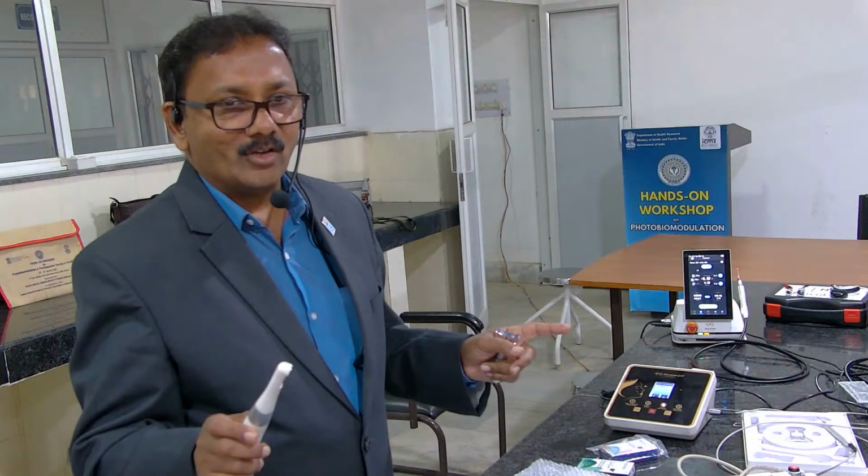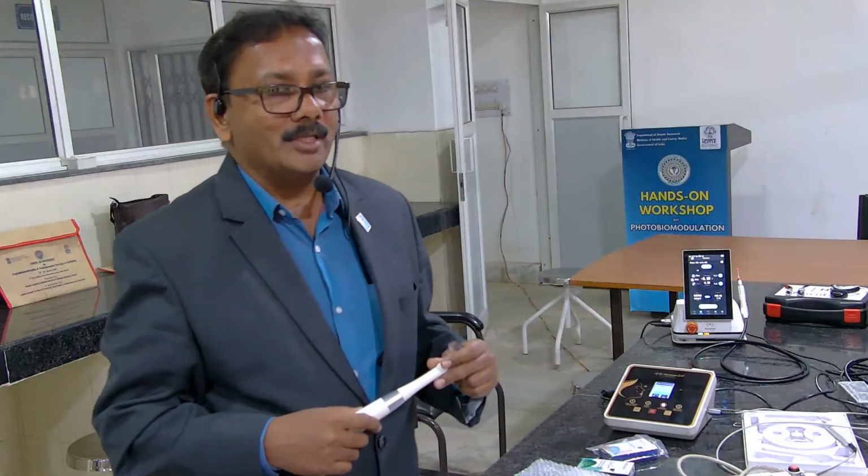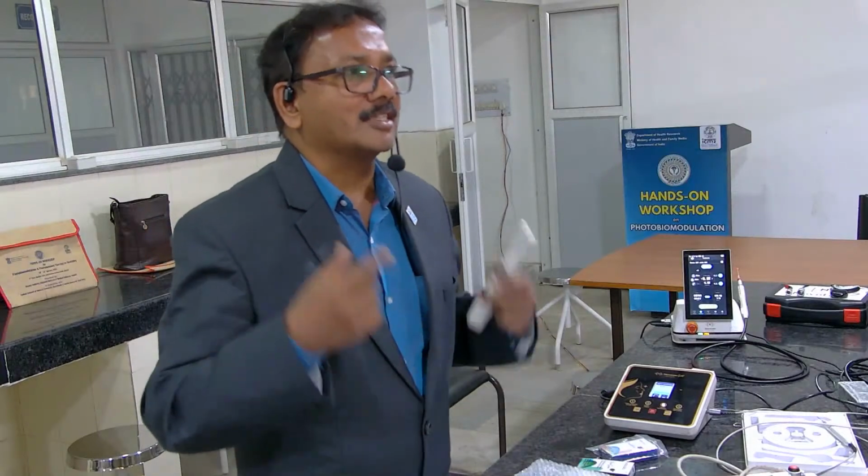Yes, it is non-thermal, it is not harmful at all. As I discussed now, I get most of the review articles, they use it as a low level laser therapy or photobiomodulation, which is extremely wrong. You can't go into thermal zone and then claim it to be photobiomodulation or low level laser therapy. Wrong. I reject the articles then and there only. Anything that goes above 500 milliwatts, you are going into thermal zone.